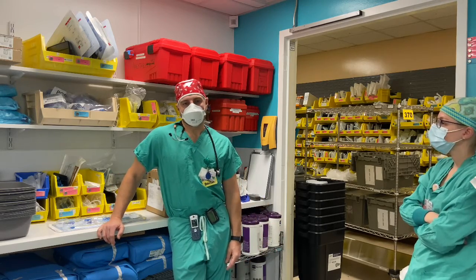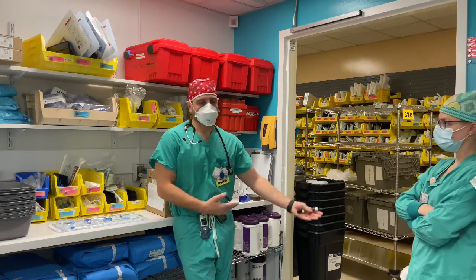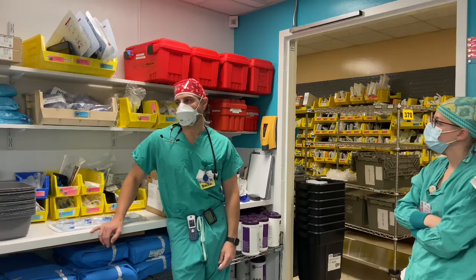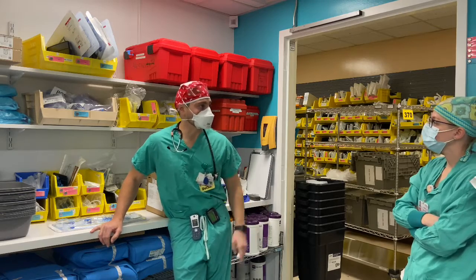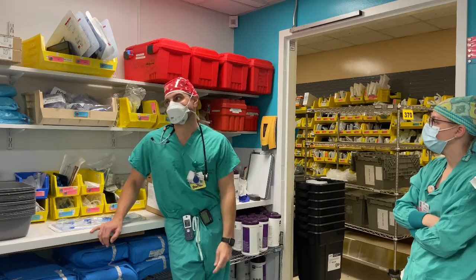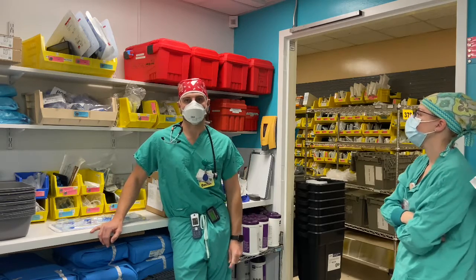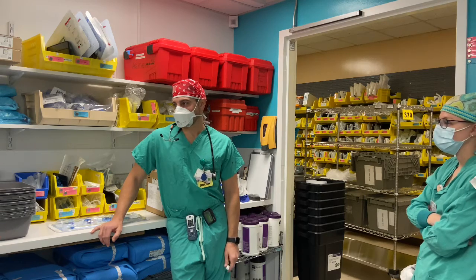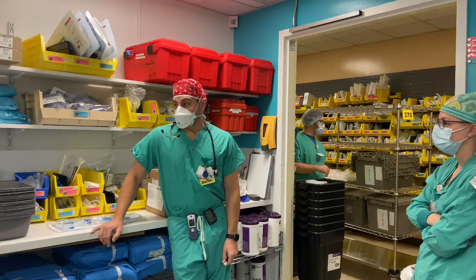And then with an ambu bag, you take into consideration how much oxygen you have in your tank and how far you need to go with that patient. I opt for 8 liters as opposed to 10 because if I'm using an ambu, it's usually because I'm going to the ICU, halfway across the hospital, and it's going to be a 10-minute walk at least. Wait, you hook up the ambu to the oxygen? I thought it was just a squeeze, like room air.